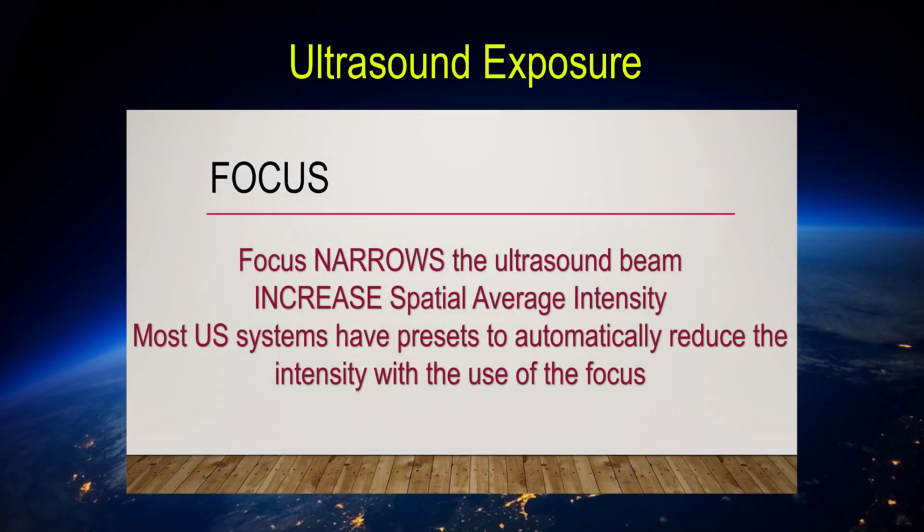The next one is focus. Focus narrows the ultrasound beam. Now obviously, concentrating the beam at a much smaller area increases the spatial average intensity of ultrasound. However, most ultrasound systems have presets to automatically reduce the intensity with the use of focus. However, it is important to remember that narrowing the beam raises the intensity at the point of the focal zone.